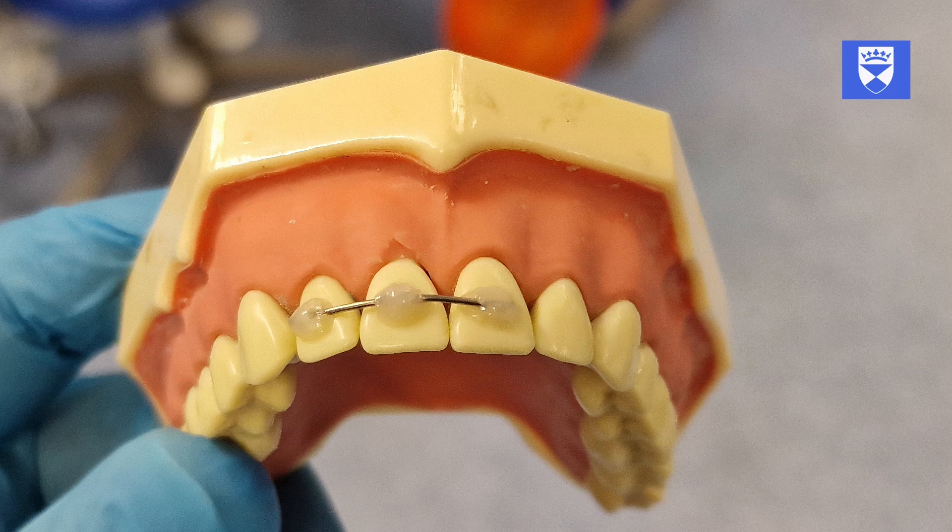Splints can be formed in a variety of ways using a number of different materials and by the nature of the injury. Full details of the management of dental trauma will be covered in your classes and tutorials. For this practical we will make a flexible splint — wire will be shaped and secured with composite resin.